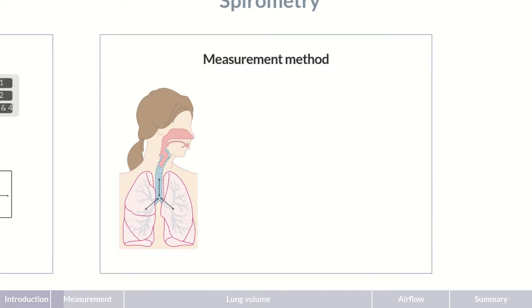The patient is asked to sit upright or stand in front of the spirometry machine and to breathe through a mouthpiece connected to the machine. Meanwhile, the nostrils are closed using a nose clip, ensuring that all breathing is done through the mouthpiece, measuring the flow of air.